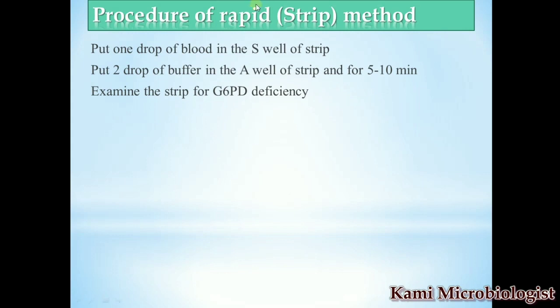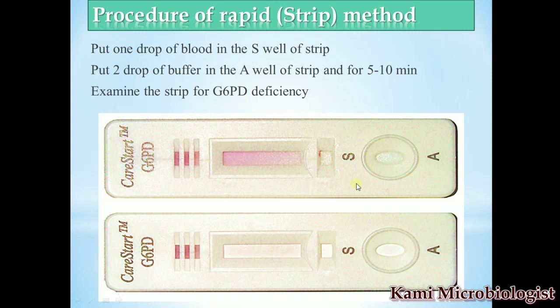For this purpose, first of all you have to take one drop of blood and put it into the strip. Let me show - this is the strip. Now you have to take the blood and put it into the sample well, as you can see.